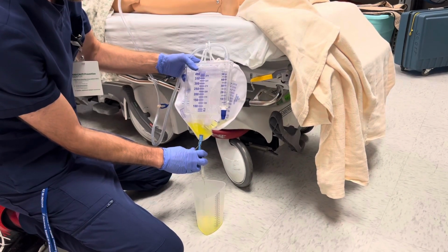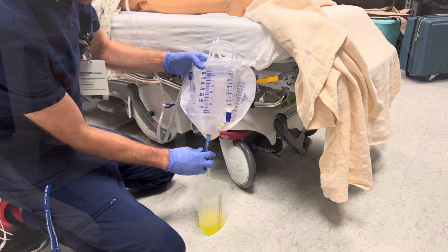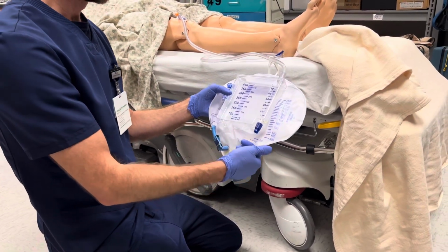Empty the catheter drainage bag regularly, at least every 8 hours, and when emptying, use a new carafe each time to reduce contamination risk. There are several reasons that a Foley may not drain.